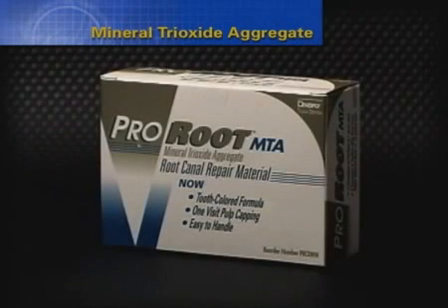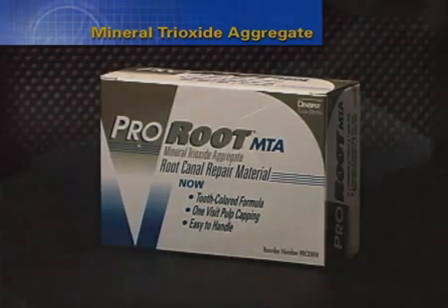Mineral trioxide aggregate, commercially known as ProRoot MTA, is a material that creates an extraordinary breakthrough for pulp capping, packing certain canals, and managing radicular repairs. MTA can be used in canals which exhibit reversed apical architecture, such as immature roots or an iatrogenic transportation. It is easy to use, non-resorbable, radiopaque, biocompatible, and is apparently not compromised by moisture.